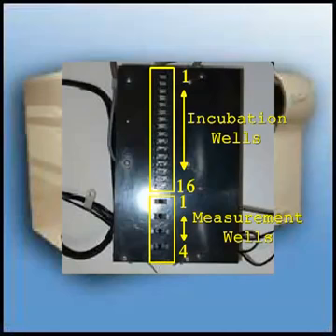This is also a good view of the measurement block, which is divided into two sections. The front 16 sections are incubation wells, which are kept at 37 degrees C. There are four measurement wells, and note that the wells are counted from back of the unit to the front — one through 16 are incubation wells, one through four are measurement wells.